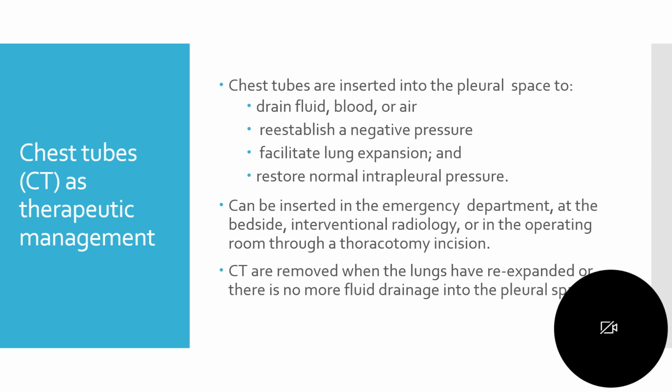Chest tubes are used as a medical management in order to drain fluid, air, or blood to reestablish that negative pressure and to facilitate lung expansion.